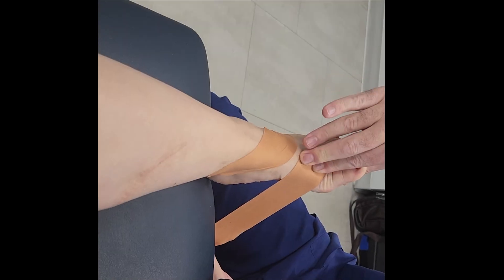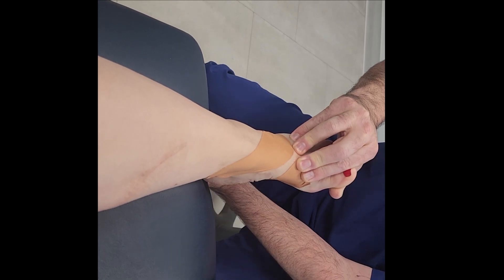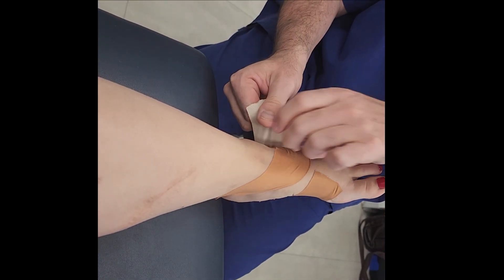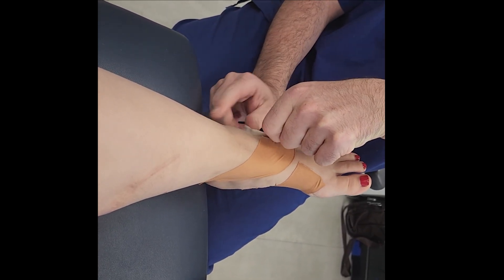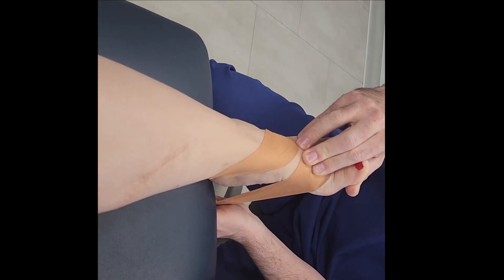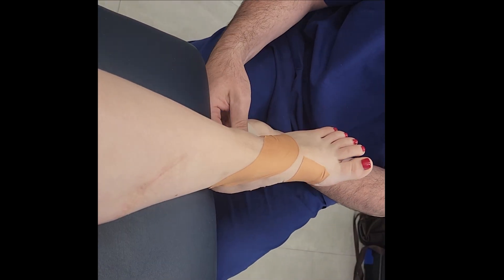The second part of the taping involves plantar flexing the first ray — pushing down with the second and third fingers onto the first metatarsal while dorsiflexing the hallux with your thumb. Anchor the taping to the lateral aspect of the foot around the calcaneal cuboid joint. Once you've got the first ray plantar flexed, pull down on the tape hard and then gently attach it to the plantar aspect of the foot.